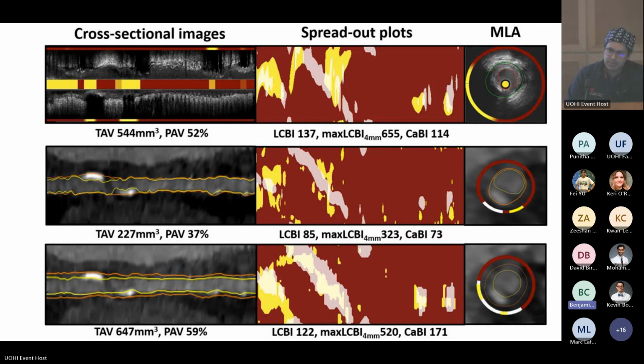Having said that, the burden of atherosclerosis predicts outcome, but we're not 100% accurate. So I would take our interpretations with a grain of salt. Some of us are a little bit more sensitive than others and will call plaque when others won't. So there is going to be variability within readers. But I think the bottom image is truth. And unfortunately, the middle image is currently where we are visually, which I would suggest all of the individuals looking after these patients take into account. So it's such an important point, Dr. Chow.